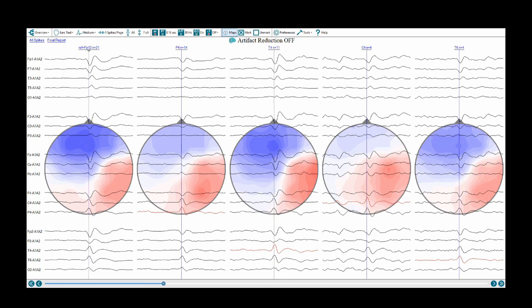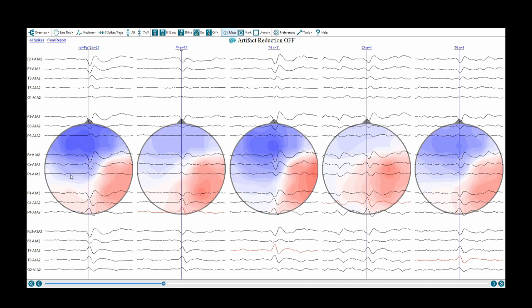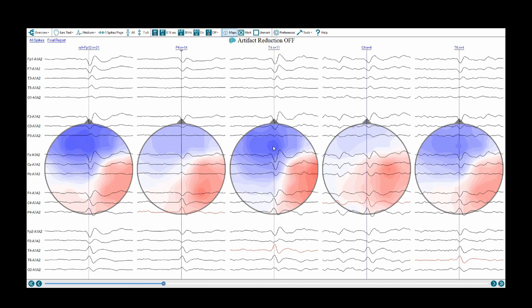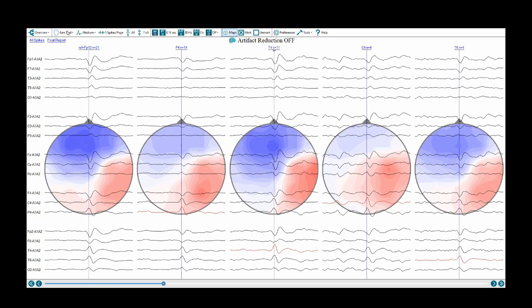If we look at the average of 14 of such discharges, we see that P4, C4, T4, and even T6 are involved in this discharge. The one over here on the left is very similar. It's just that Persist is treating it as an average or generalized discharge. But you can still see that for all of these, they all have the same dipole distribution. The T4, N equals 11, has a beautiful positive dipole of confined area. This is showing you the clear dipole separation at this moment in time. If this were a radially oriented discharge, we would only see the negative component. The positive component would be deeper inside the cortex.